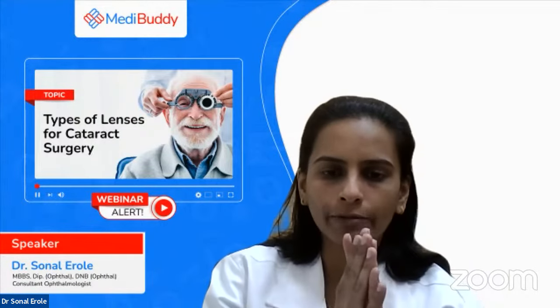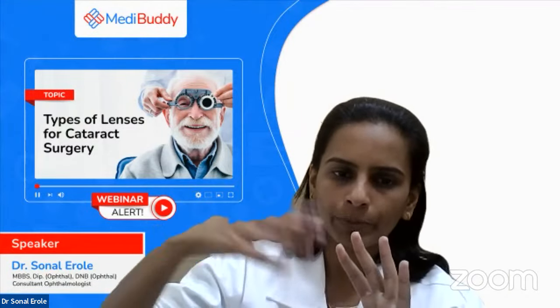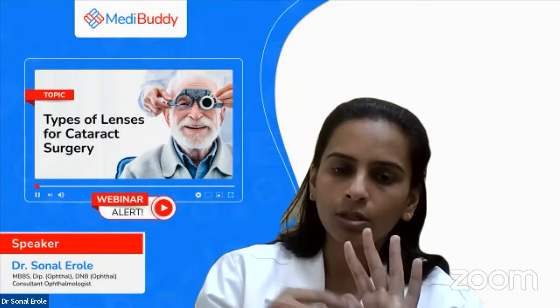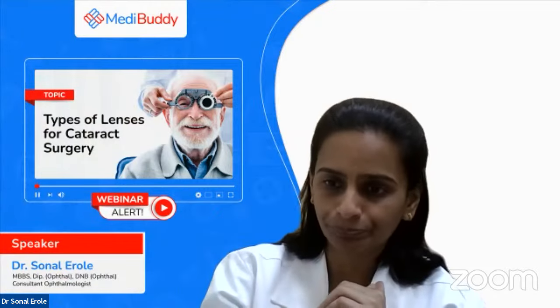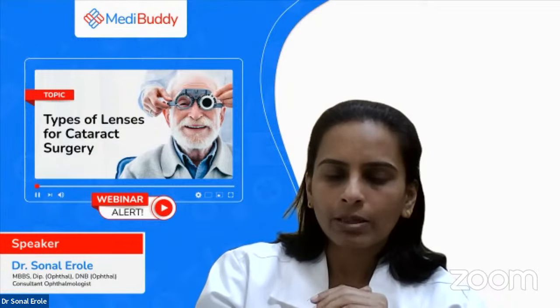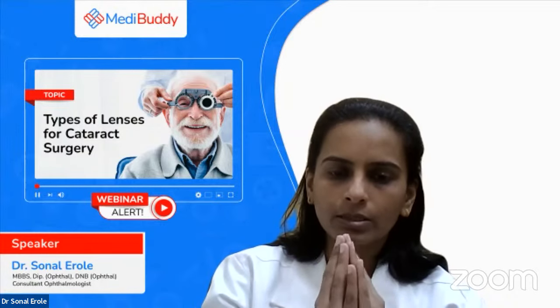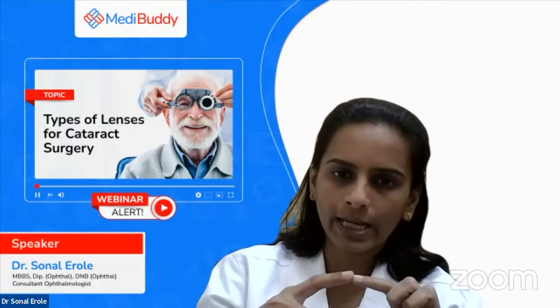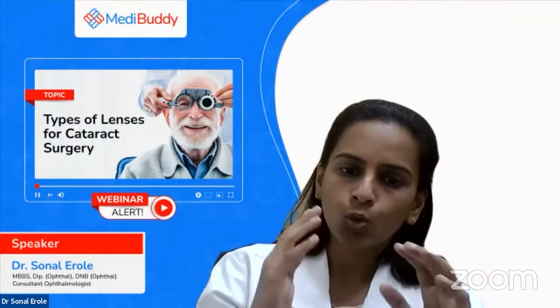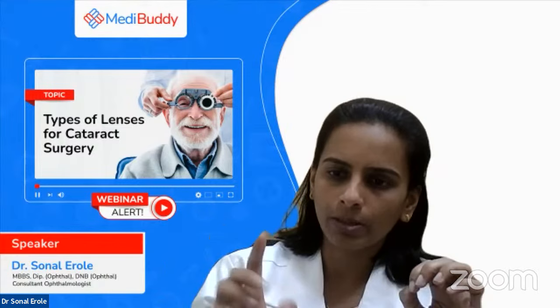It is just like our pens. We have a pen of 5 rupees also, and if we are going for expensive pens, like a Parker pen and all, we do have a different manufacturer for this. So what is the difference between basic and expensive lenses? Whenever we are putting an intraocular lens, it is after calculating the eye power for the patient. The aim with the basic lens is good distant vision.